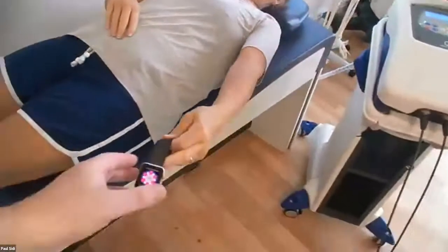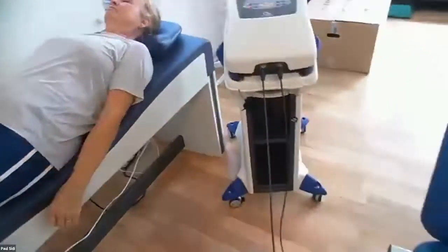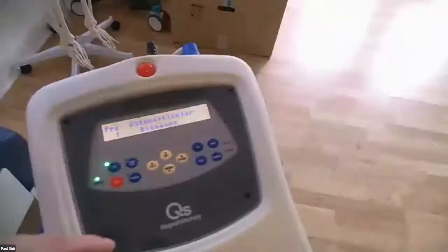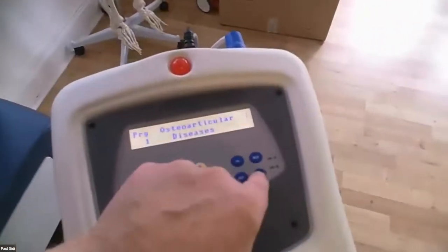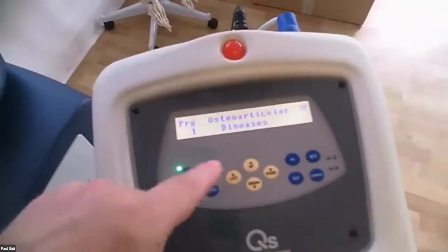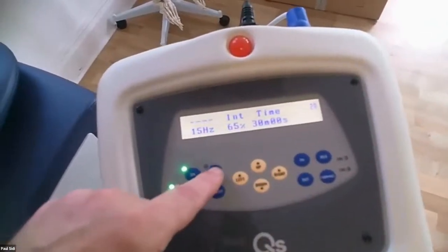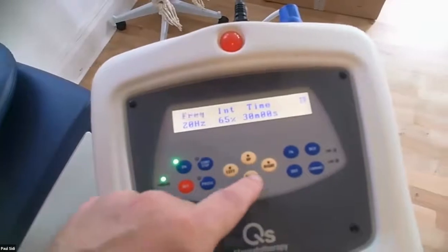Here we've got the patient, we've got the sesamoiditis, so we're right underneath there. This will be sending a load of pulse electromagnetic fields right through this solenoid. Get the patient to take their watch off. You don't stick them on here if they've got a pacemaker in. What I'm going to do here, I'm going to go back on, go to channel 2. Okay, I'm going to go in again. Let's go up hertz.